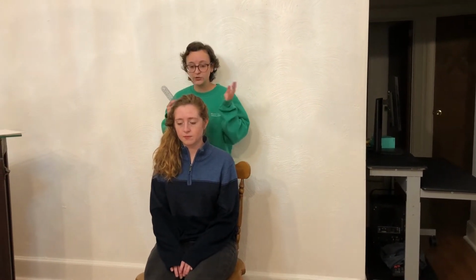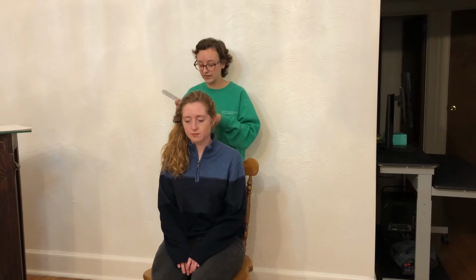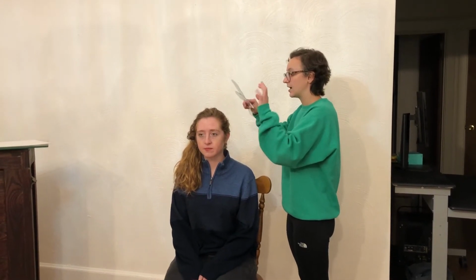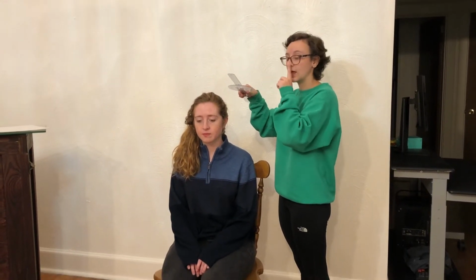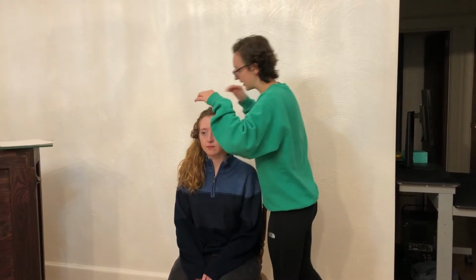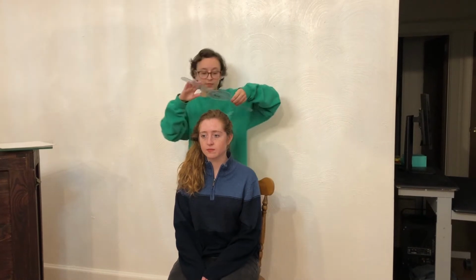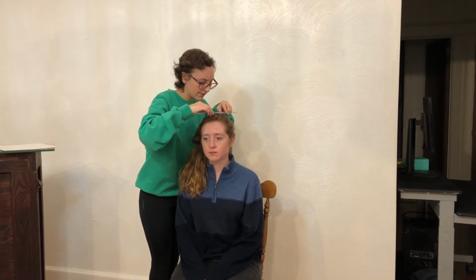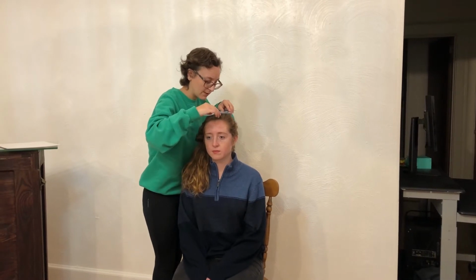Now what I'm going to do is test my patient's cervical rotation. So I'm going to have the stationary arm out toward the back and my movement arm out toward the front, lined up with her nose. So I just want to make sure I'm in a position where I can line it up with her nose. So I've got the fulcrum at the top of the head.